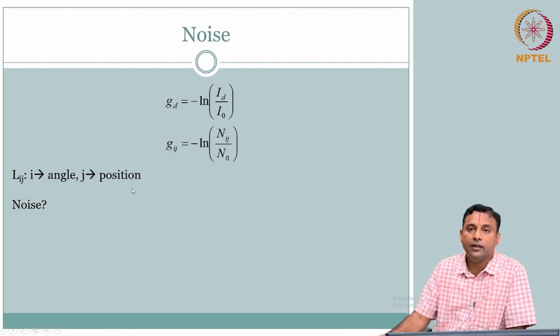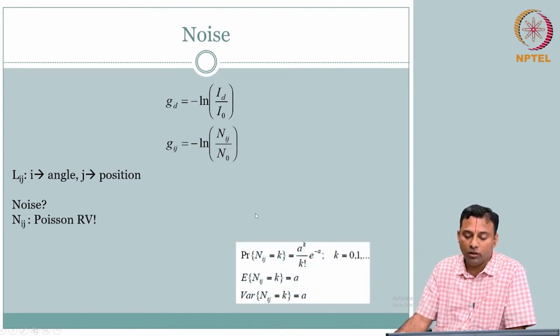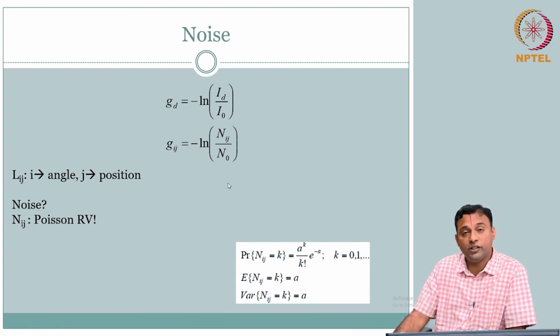Each time a burst is happening, each of the detectors probably is not getting the same number of photons because of that. So it actually comes out from a distribution called Poisson's. It forms a Poisson distribution, which we covered earlier, right? Why is this important? The mean and variance are the same value. The variance is also the same value. That is the idea of this guy, Poisson. That is a characteristic of the Poisson random variable.